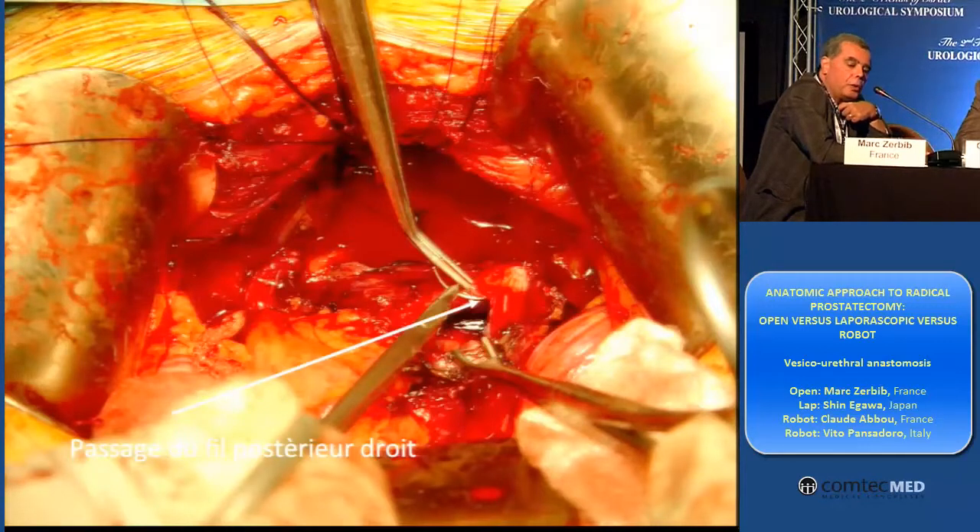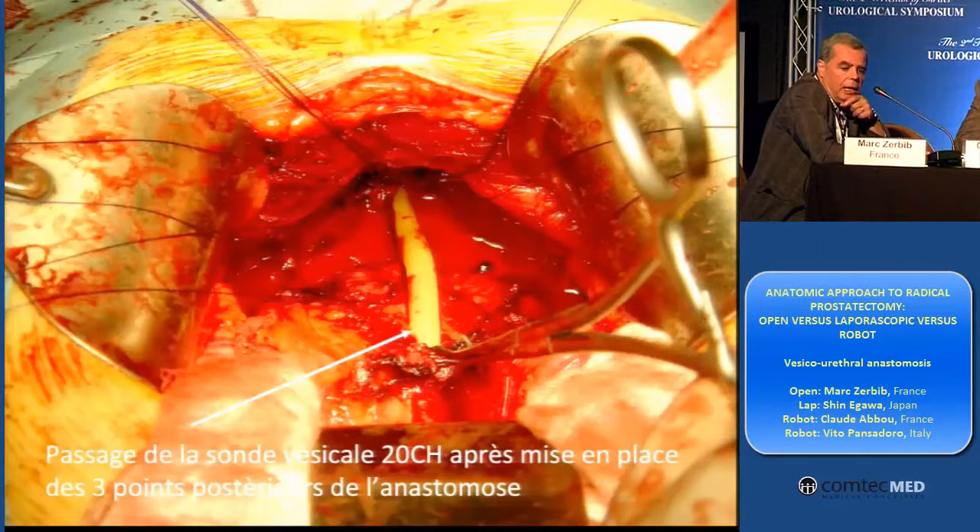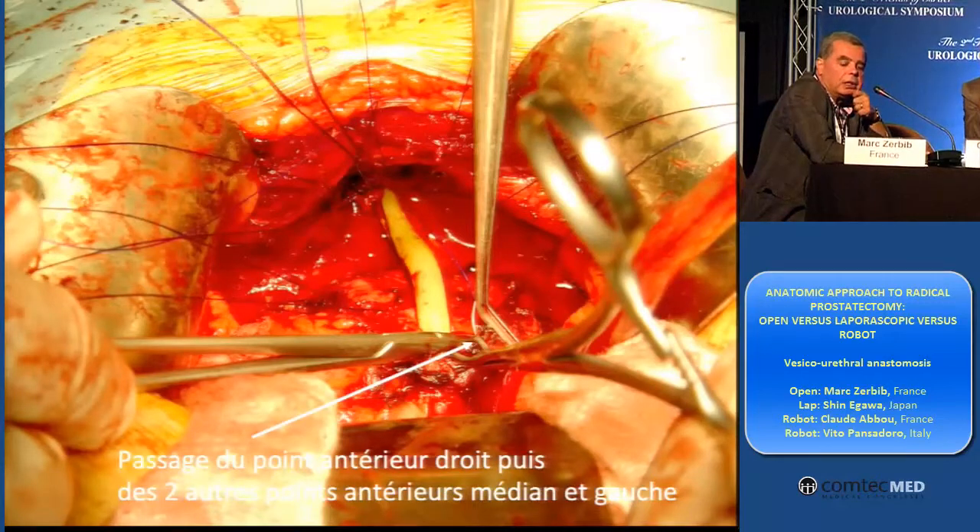First, I put my three posterior stitches using the other needle. And I can go by outside to inside. I put the three posterior. And after I introduce the catheter. And I put the three anterior stitches in the bladder neck part.